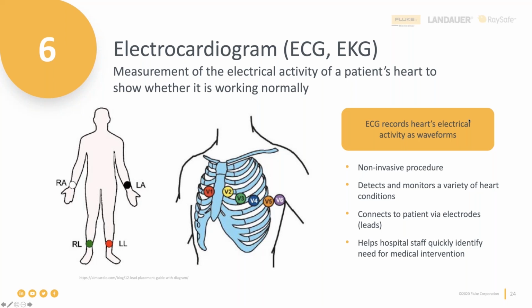For example, I think the inferior infarct is located on that side of the heart. So again, it is critical to test the ECG devices, because if you do not, this will lead to possible misdiagnosis, patient mismanagement, and inappropriate procedures done to the patient.